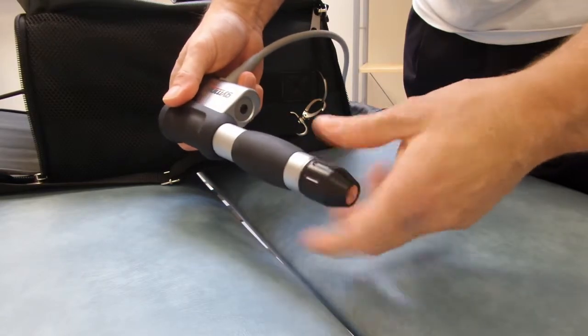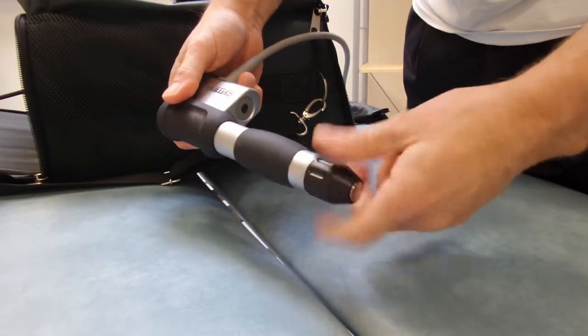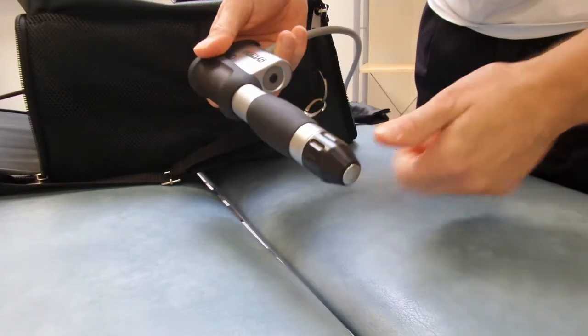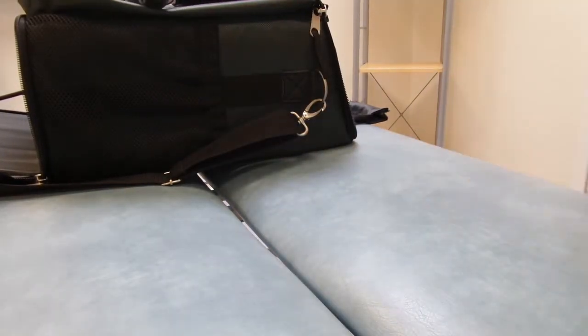Start by removing the 20 millimeter head and replace it with a 15 millimeter convex head. You can tell this is the convex head because it's got the silver tip and not the copper tip.